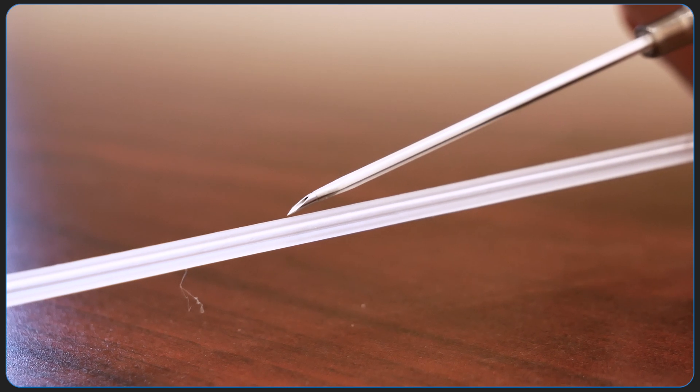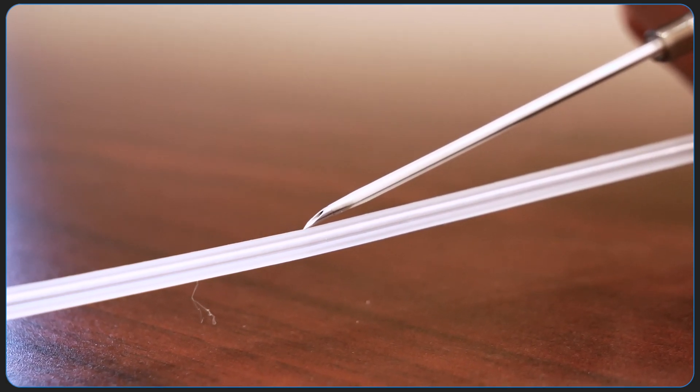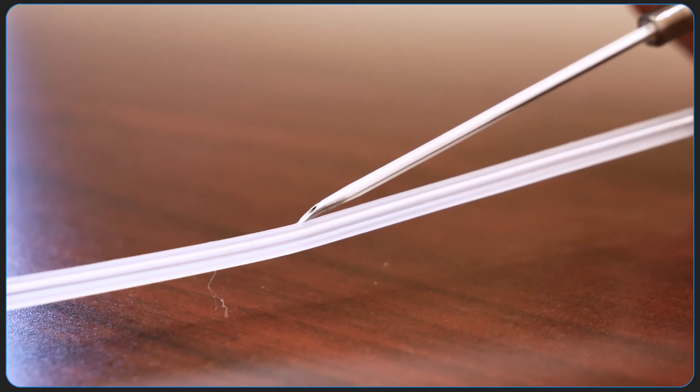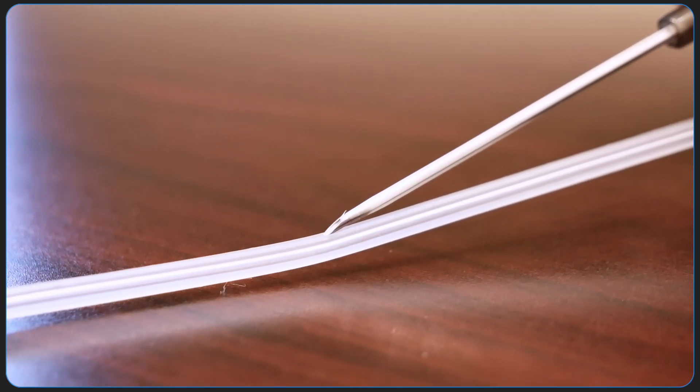This compliant tube is going to simulate our vein. So remember this tip is cutting so you don't need a whole lot of angle down to actually start going through the anterior wall of the vein. You see that there?